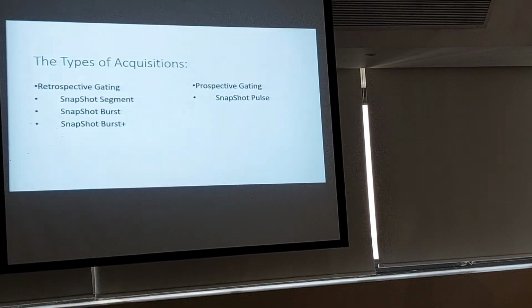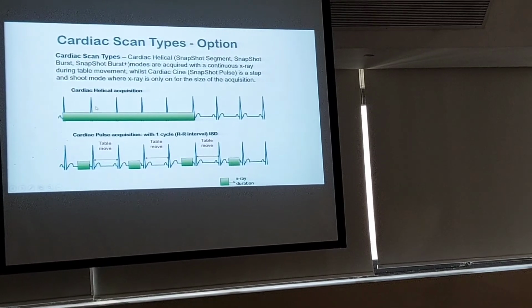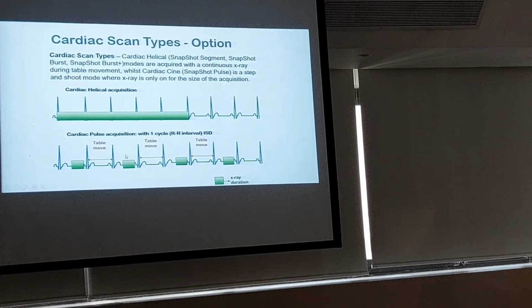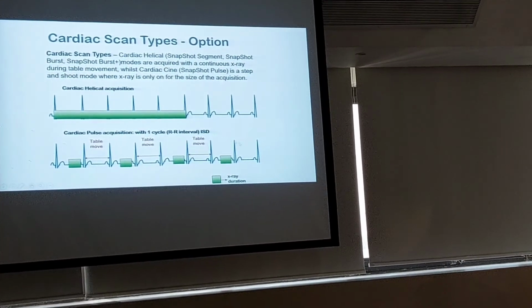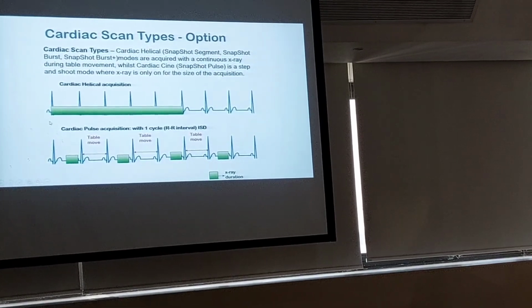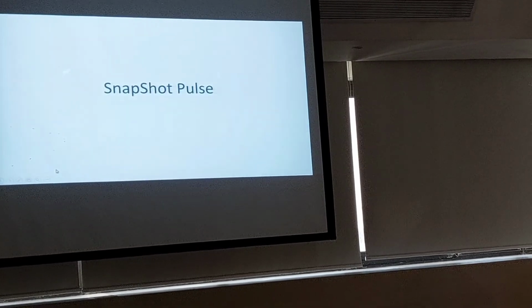This is the difference between the retrospective gating, with one continuous exposure, and the prospective gating: exposure, table move, exposure, table move, and so on. So the total time is longer, but the exposure time is this and the dose is this, prospective compared to the retrospective.